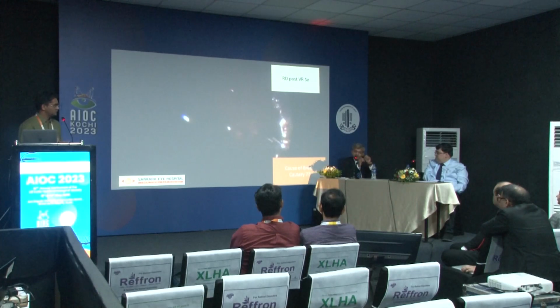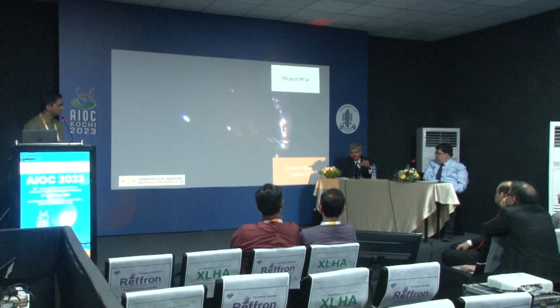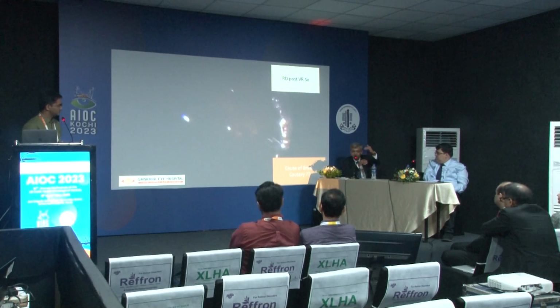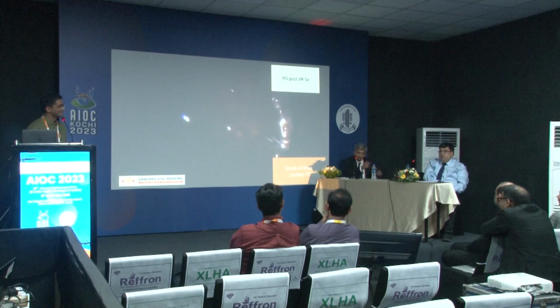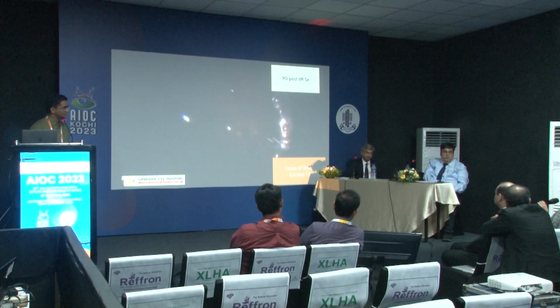That's true. So one way to get around this is, normally if you're using endolaser at 120, 150 power and a duration of 100 milliseconds, instead of increasing the power if you don't get the laser burns, increase the duration. Long duration laser is safer than high power short duration. Short duration high power will create a break. Long duration low power is like cooking on a slow flame. You can use that instead of cautery also.